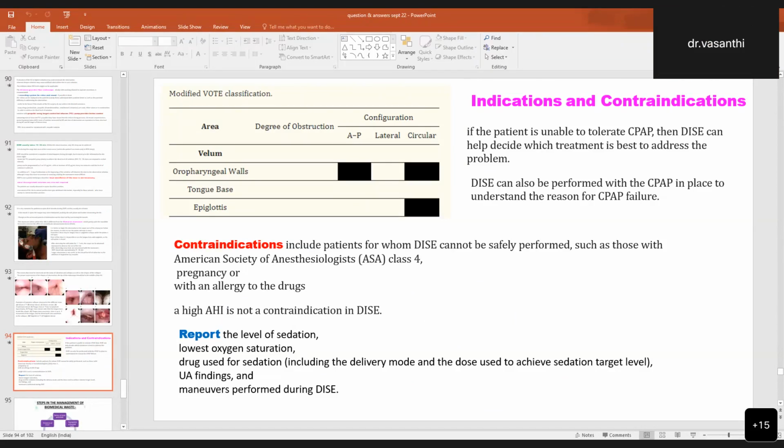That is not what we are talking about. We are not talking about this procedure lightly. Don't take it lightly or get pressurized by the ENT surgeon or other people just to give some propofol and finish it off. Don't take it for granted. Be always ready to face any crisis, especially obesity, OSA patients. You should be doubly careful. Yes, sir. Very demanding, sir.